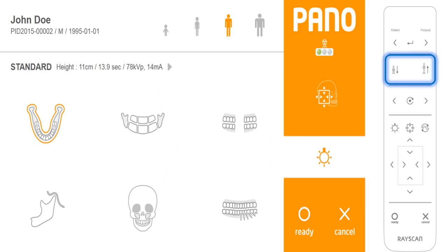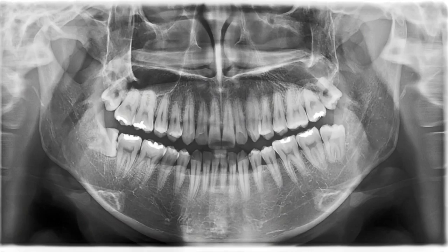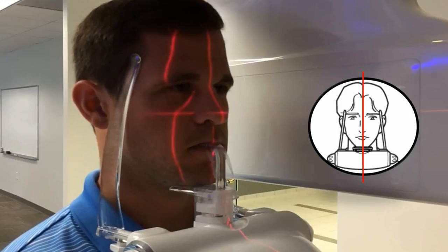Press the up and down buttons to adjust the height of the chin rest so it is slightly higher than the patient's chin, so that the patient will have to stretch up to place their chin on the chin rest. Excellent image quality is a result of careful attention to positioning. Ask the patient to rest their chin on the chin rest, and place upper and lower anterior teeth into the groove on the bite stick.